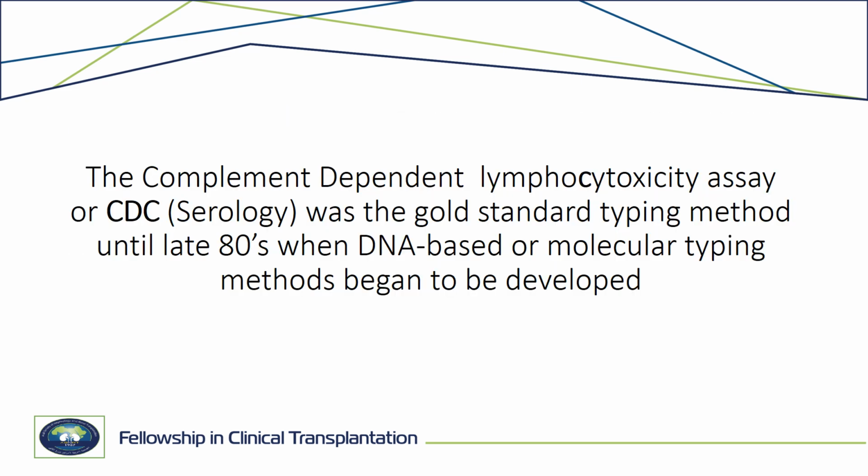The complement-dependent lymphocytotoxicity assay, or the CDC, was the gold standard typing method until the late 80s, when the DNA-based or molecular typing method began to develop. But until now, there are still labs that use the CDC for HLA typing, or at least they use it for cross-match, as we will see in our cross-matching presentation.